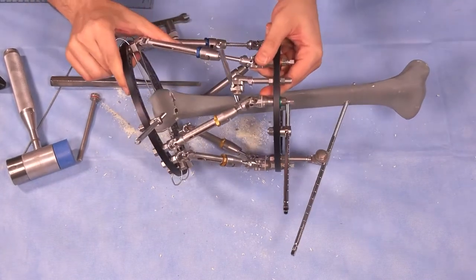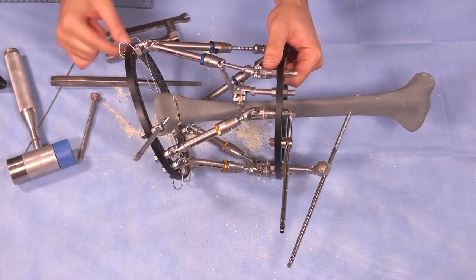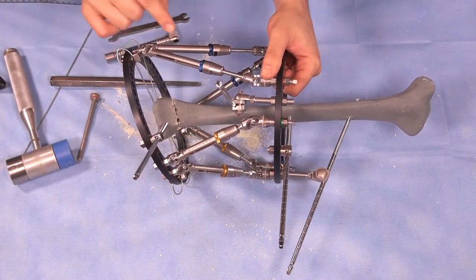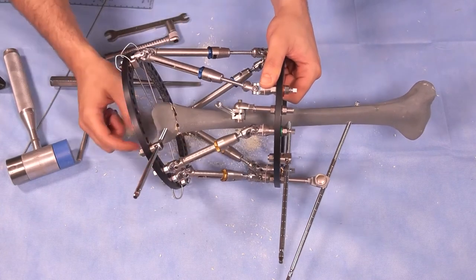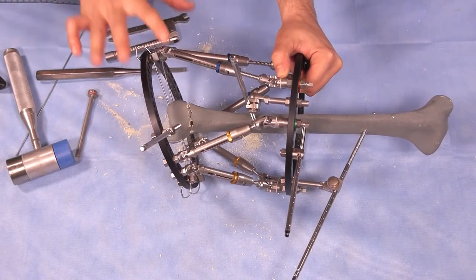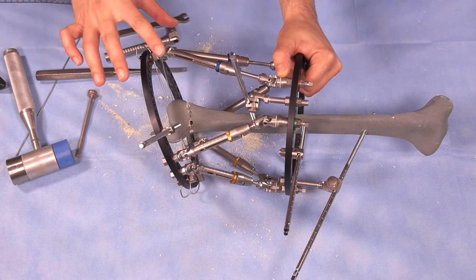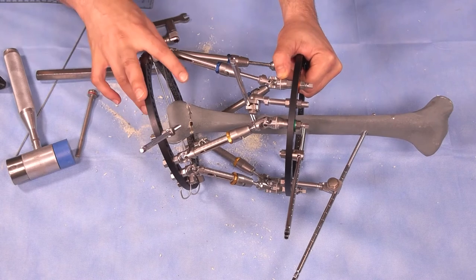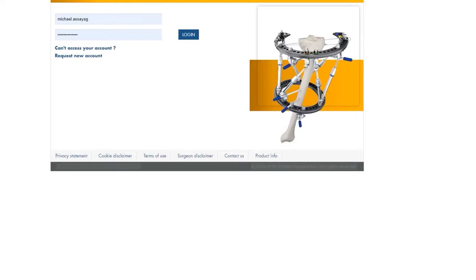Once the osteotomy is done and the struts are unhooked, you must reattach them exactly in the right place at exactly the same numbers, because that recreates your baseline deformity to correct. We then go to a computer, open the program, take x-rays, and use the software to generate the deformity correction program.